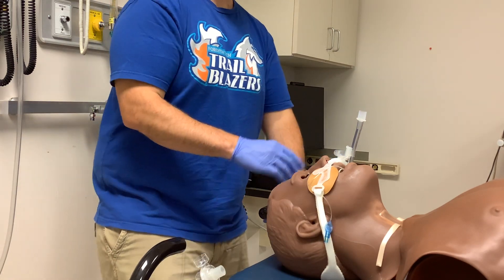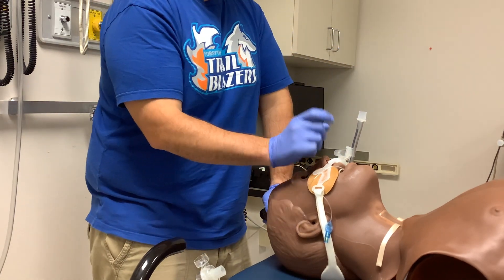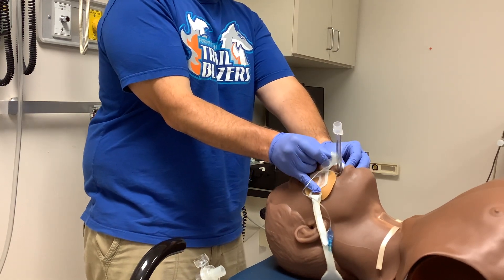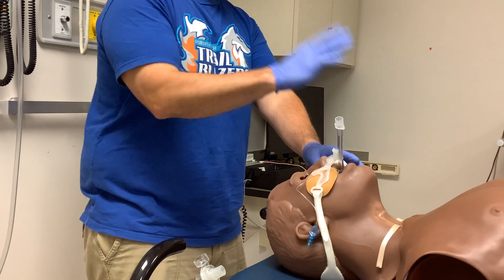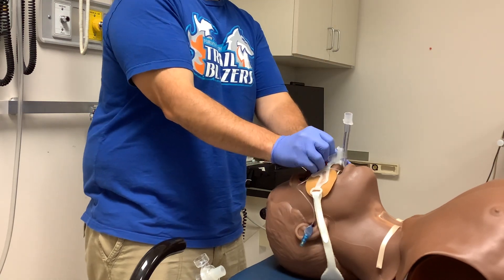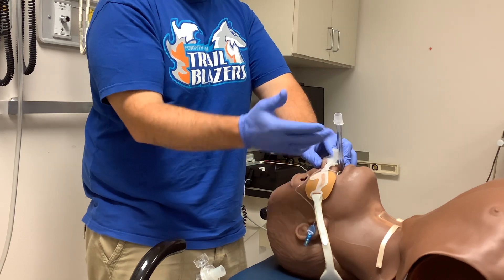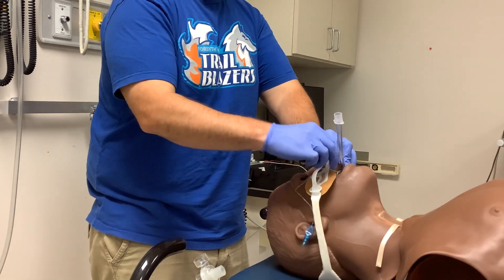The cool thing about this is, as part of hospital policy to prevent pressure sores from building up, I can pinch these items together and move that tube to the other side — to the right side, to the left side, or back to middle — and I can do that every few hours. That's how you would utilize the commercial tube holder.